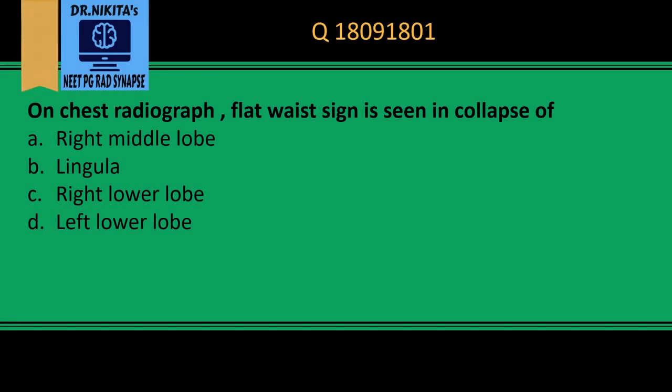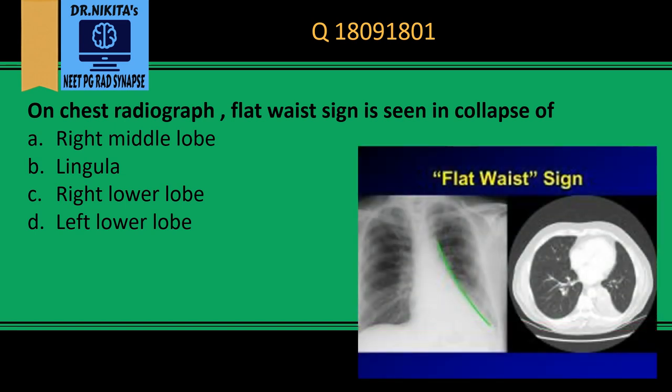On chest radiograph, the flat waist sign is seen in collapse of the left lower lobe. The flat waist sign refers to the loss of the normal contour of the aortic arch and the pulmonary artery.